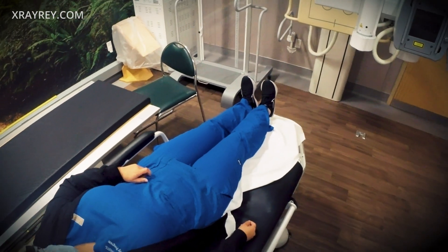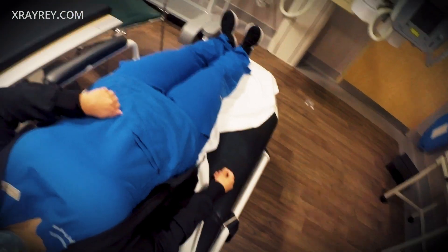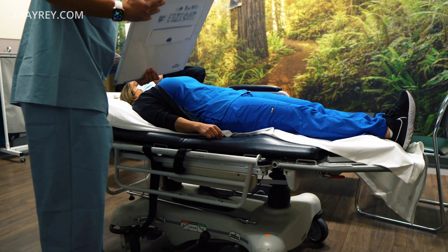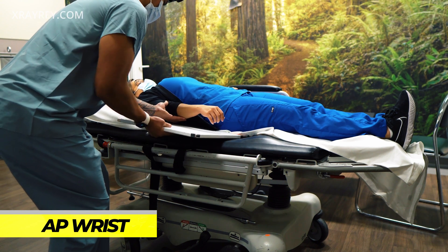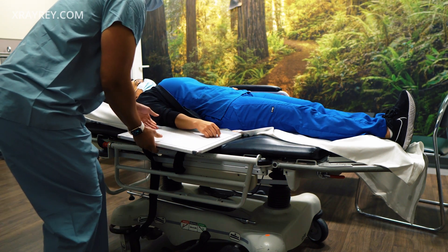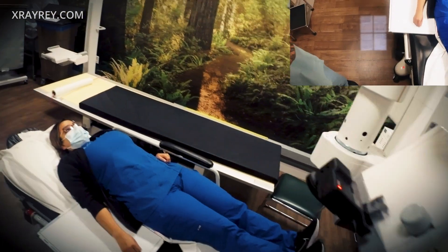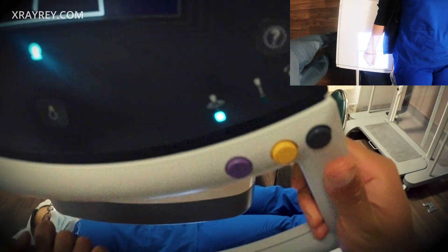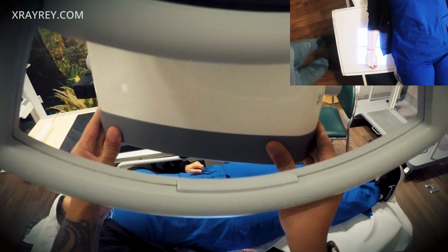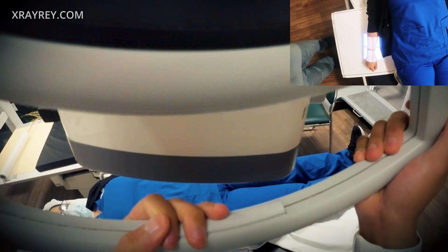One, two, three — you're doing all right? Yes? Okay. I'm gonna put this board under your wrist here, okay. I'm just gonna kind of help you up here — good, doing all right? Yeah? Okay. I'm gonna lower it down there. Good. All right, great. I'm just gonna take a look right here.